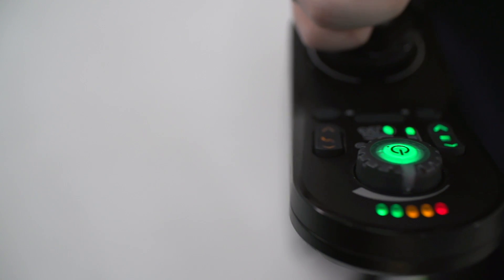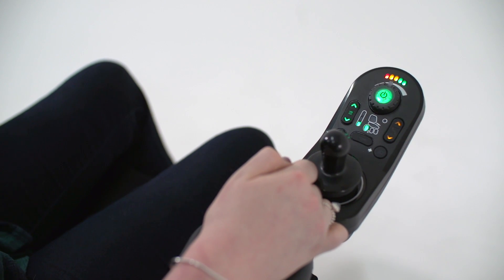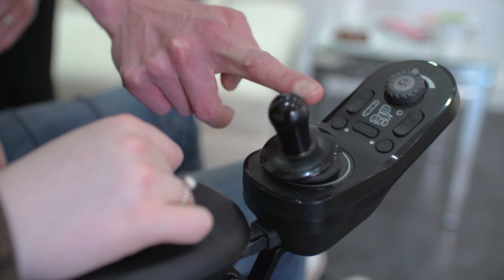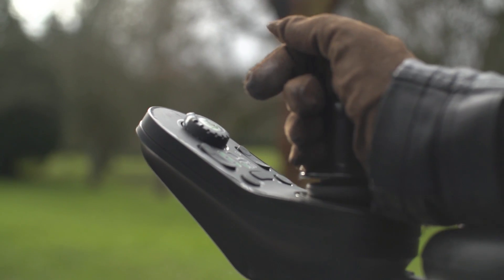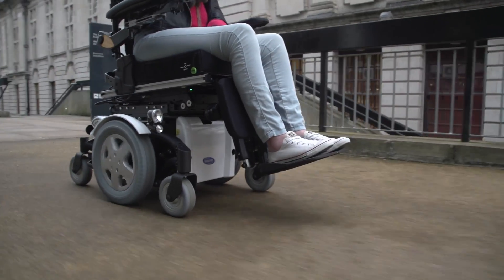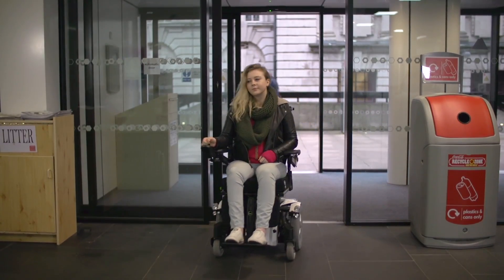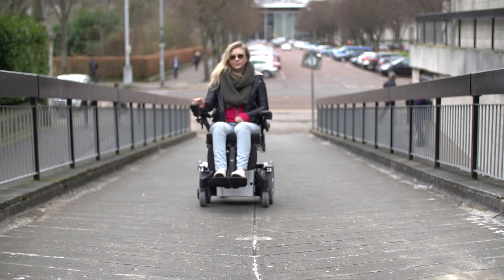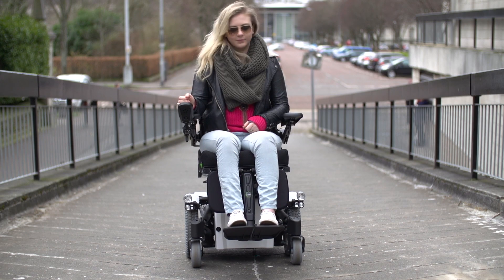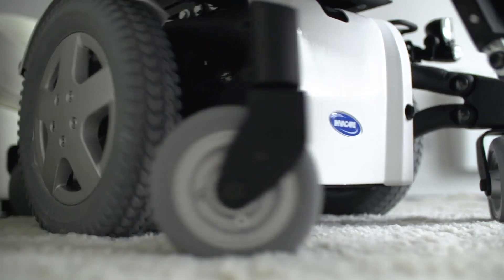This is exactly what dynamic load compensation has been designed for. Built into the new Lynx system, the innovative technology ensures motor resistance levels are set correctly for the user, allowing for more accurate control. When going through doorways or approaching tables, its predictable low speed control makes it a simple and straightforward process. It also allows the user to drive with confidence on any surface, camber or incline, with improved hold on slopes and reduces the effect of caster lock on soft surfaces.